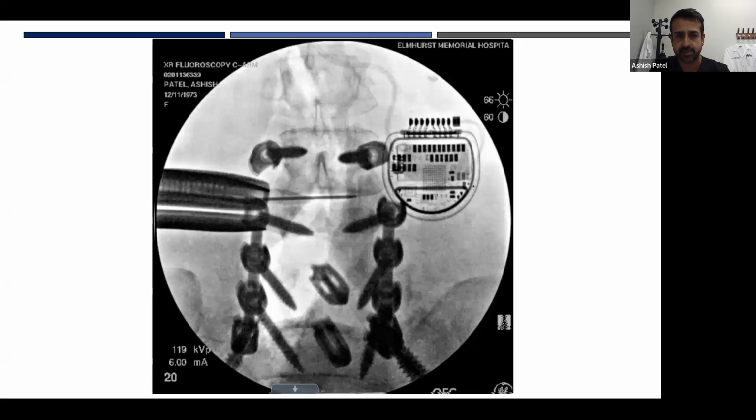It needed to be addressed. And we wanted to address that by placing a hyperlordotic implant. And so the nice thing about this is that objective number one was a large osteotomy to correct or restore the PI to a more reasonable number.